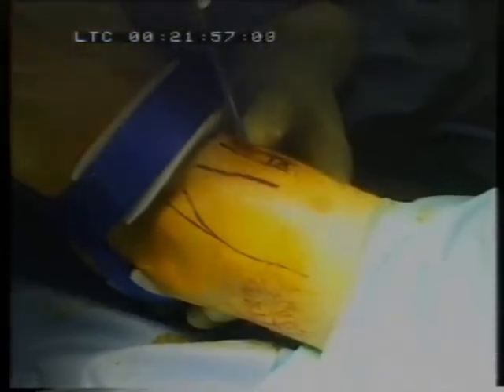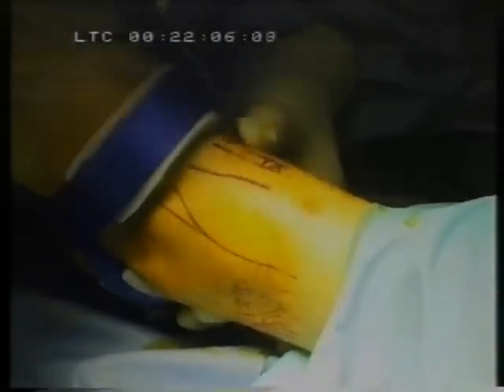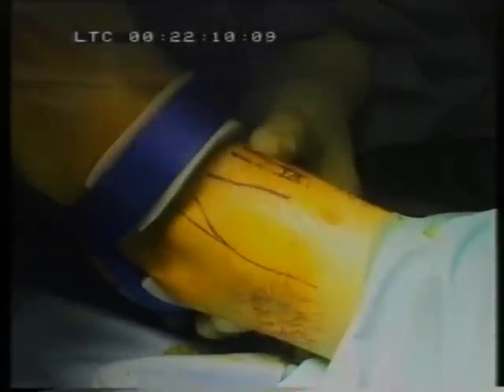The next part is blunt dissection. I blunt dissect through the fat and push from side to side in order to push away the vascular and tendinous structures in this region of the ankle.